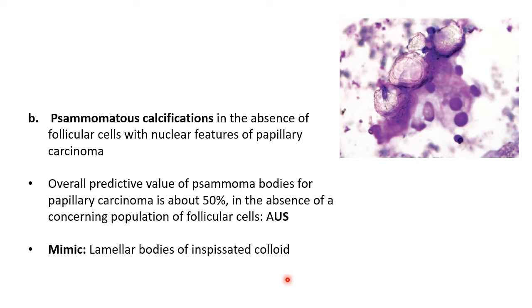So the psammoma body calcifications should be differentiated from inspissated colloid bodies, which may be present in the thyroid FNA.